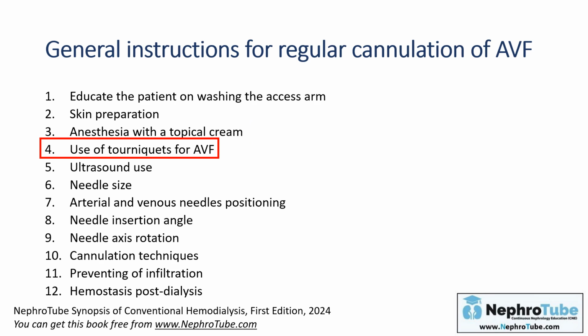For sure, use of a tourniquet helps to enlarge the veins and facilitates AVF cannulation. Again and again, the use of ultrasound is reasonable in the AV access of selected patients to prevent cannulation complications.